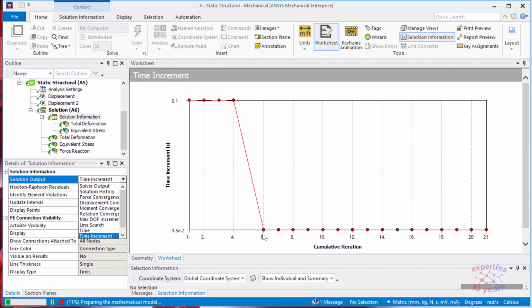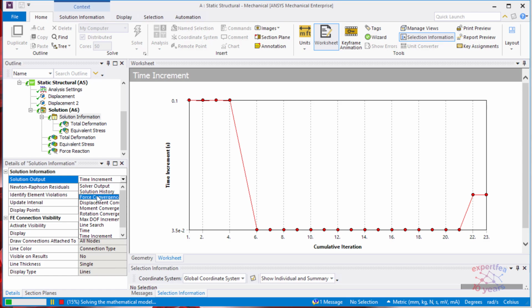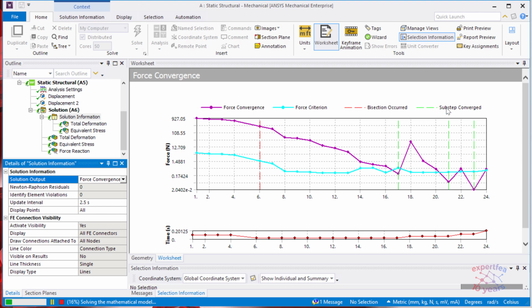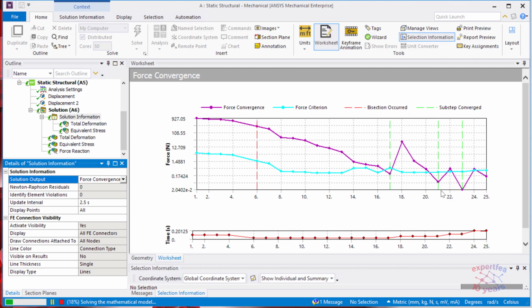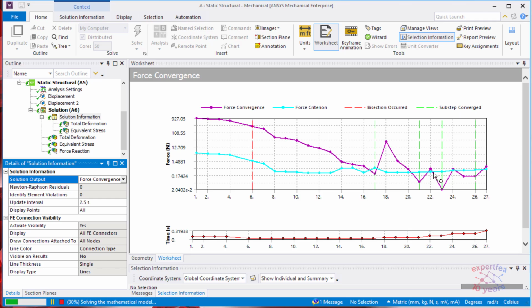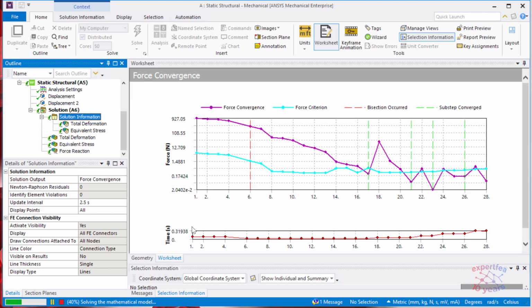Let's go to the fact that it doesn't decrease anymore. This means that it found the proper convergence. Also, when the time increment is increased, then we have a nice convergence, which can be visualized by clicking on force convergence here. Look here, step, or let's say something like time step. You can equate these two terms. What we're looking for is the force criterion, this green line, to be above the force convergence line. And you remember the end time is around 1 second, and we are already approaching the half of this solving.